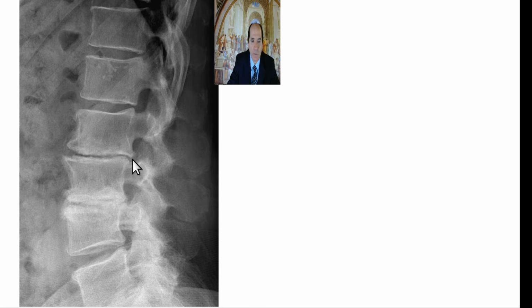Okay, you've got a little bit of retrolisthesis here, a posterior bone spur. So you're heading into OPLL, ossification of the posterior longitudinal ligament. Sometimes the posterior spinous processes will start to rub against each other and get erosions and sclerosis. That's called Baastrup's disease. Anyways, all of these things are indicators of where the patient's at.